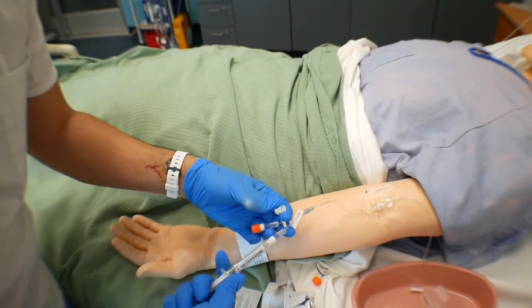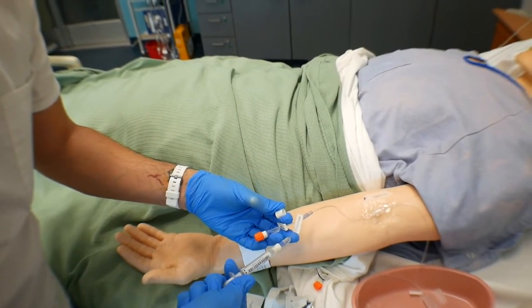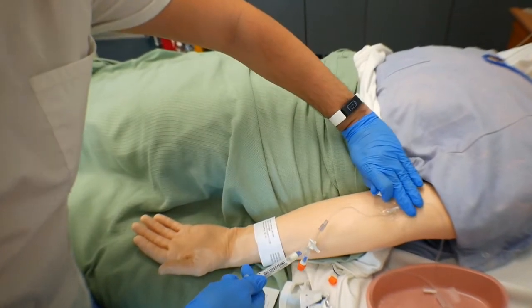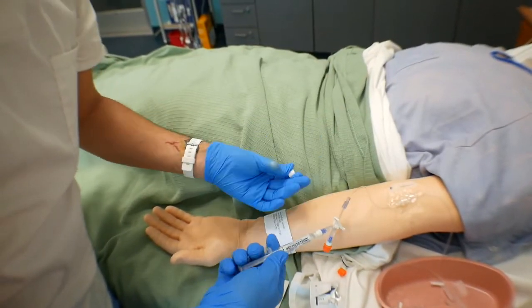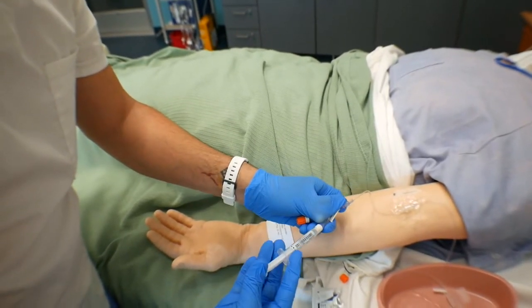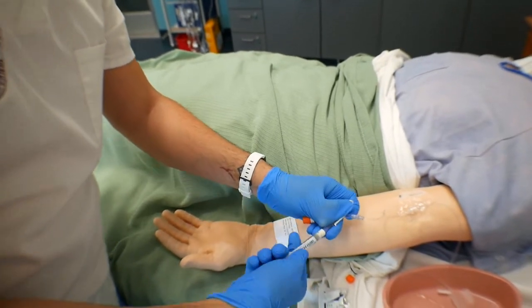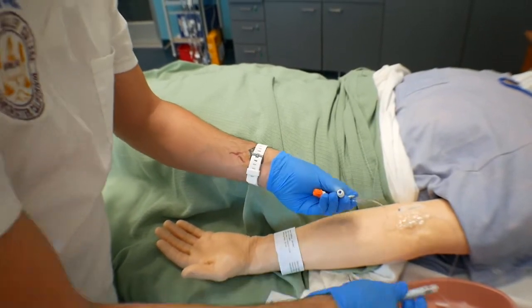As you push the normal saline, make sure there's no resistance, and you're gonna ask your patient, Mr. Smith, do you feel any pain? No? Okay, good. You're gonna touch the side if it's cold. Check if it's leaking. So this one's good. So obviously it's infusing.